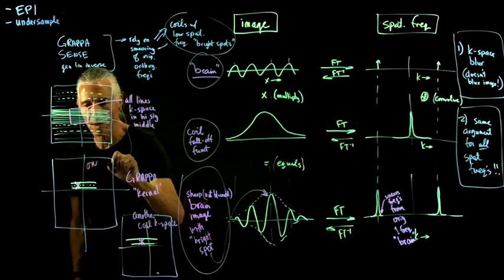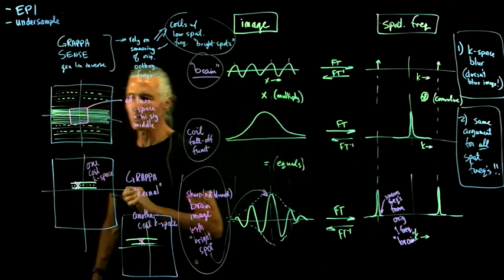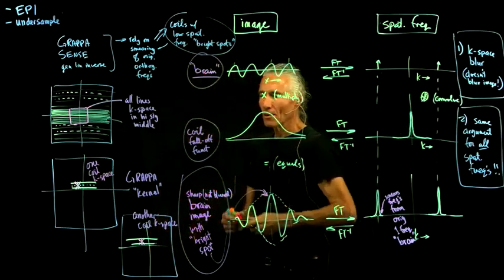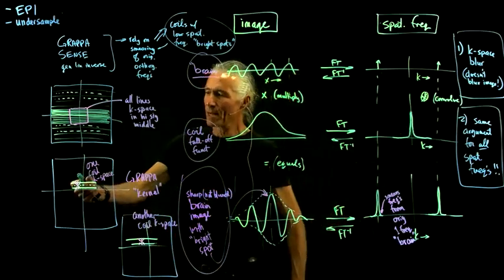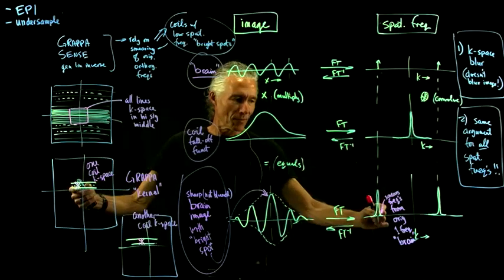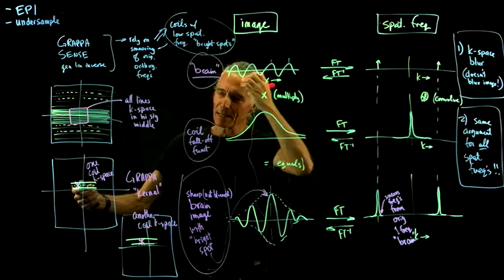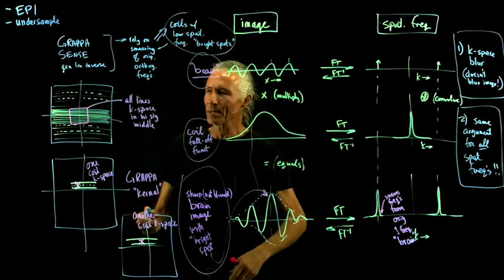This is one coil K-space, because the coils are on at the same time, and so we're getting a full K-space for every coil. Not only do you have the surrounding lines, which have some information from every spatial frequency in them, but you also have multiple coils.